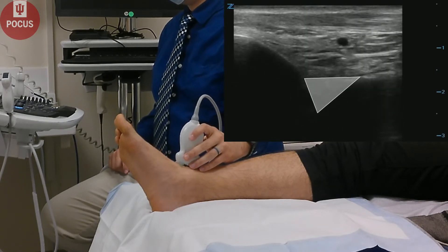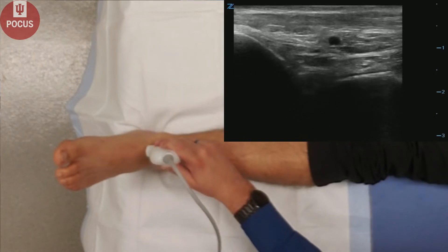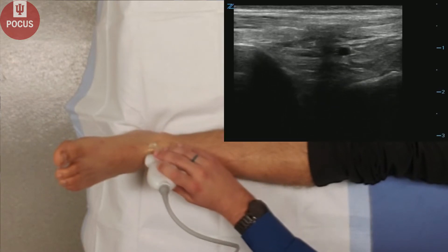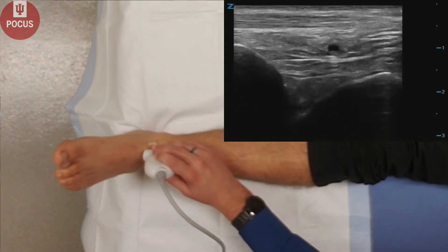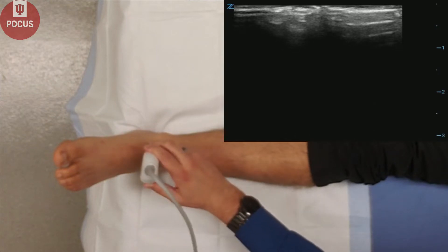This is the joint space. There's some synovium there, and you can often see joint effusions, but they can be small, so make sure you look both medial and lateral throughout the whole ankle joint looking for any joint effusions. You can also dorsiflect the ankle to bring out any joint fluid in that space.